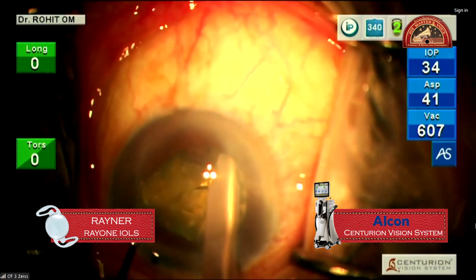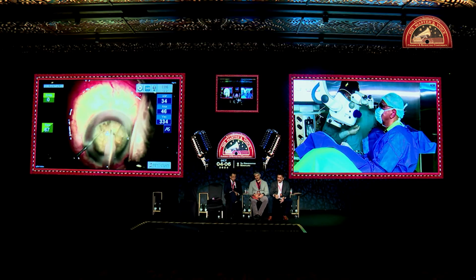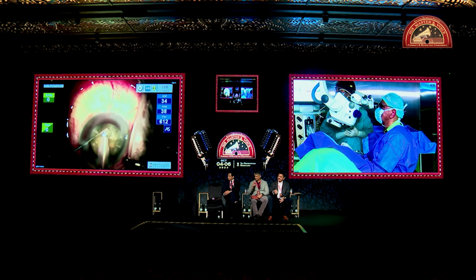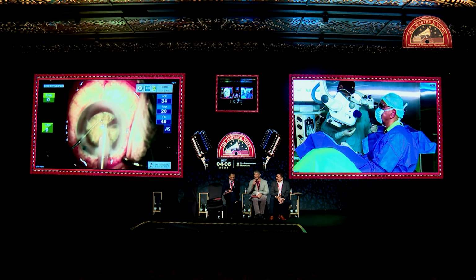So I'm going to separate it. Yeah, it is separated. So my question to the panelists: any tips for handling high myope patients with this grade of cataract? Use the Myloop, it will be easier. You'll be finished now.